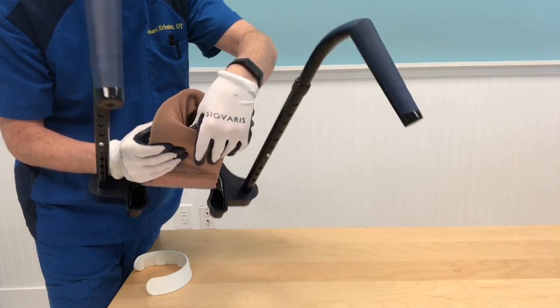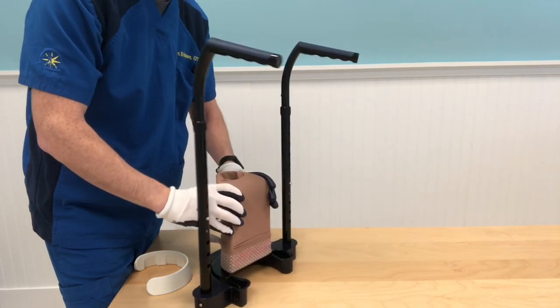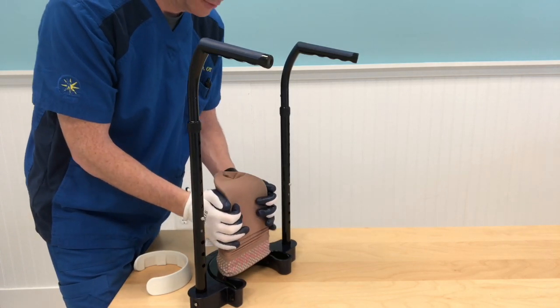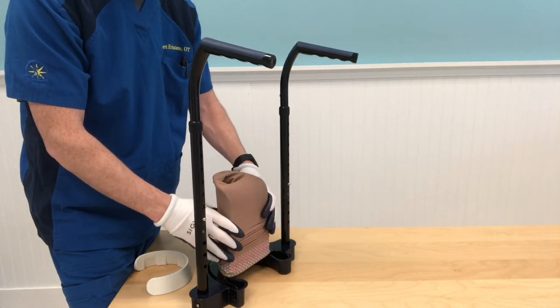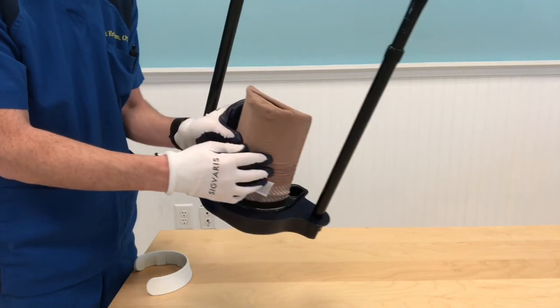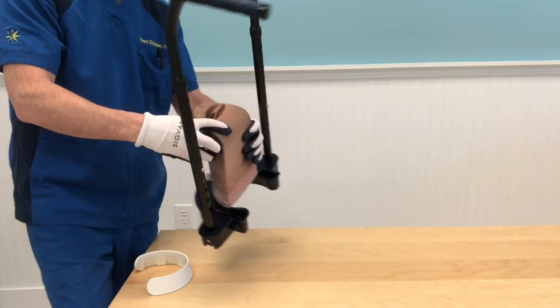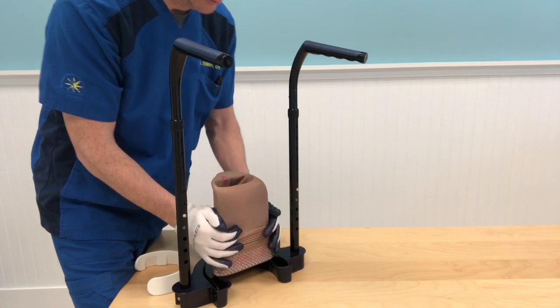As you're loading it, you want to make sure that you're lining up the hole towards the center as much as possible. You can see that I'm using the palm of my hands rather than fingertips, and there's the heel of the compression sock. At that point, you want to make sure that that's still lined up where you want it, which is right there in the center.